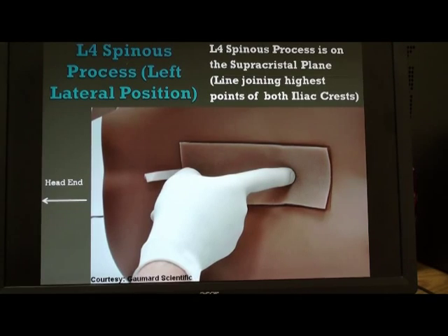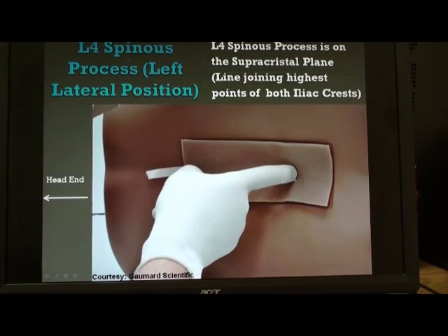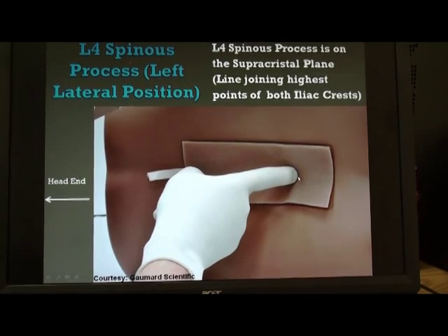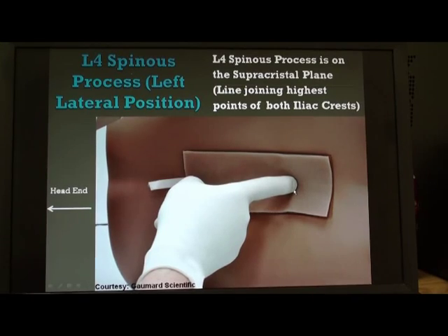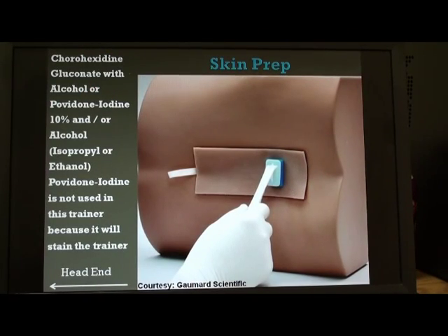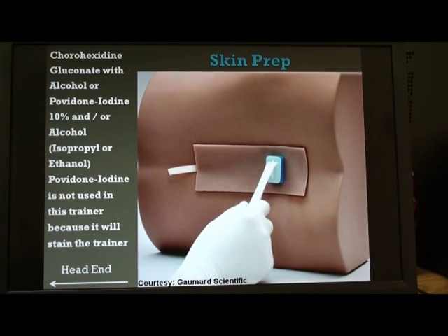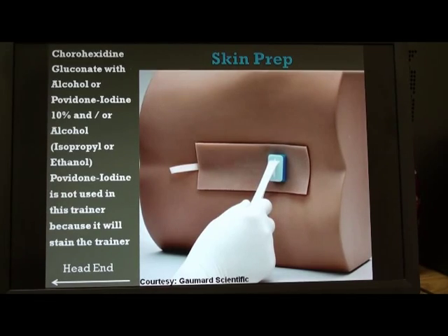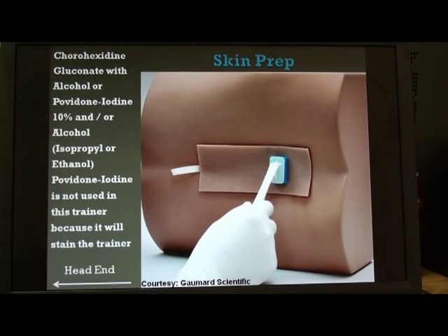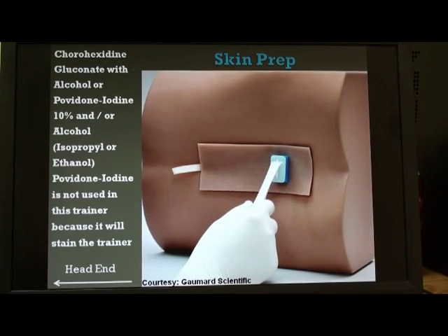Once we have the L4 spinous process, the space just above it is the L3-L4 space and the space just below is the L4-L5 space. We usually choose the L3-L4 space for the lumbar puncture procedure. The next step, once the patient is in position, is to hyperflex the spine. That is done by flexing the neck so that the chin touches the chest and the knees touch the abdomen, which opens up the interspinous spaces.